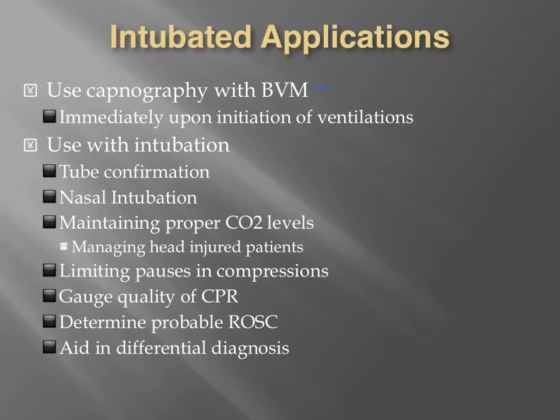That will help us get a truer measurement of carbon dioxide release from the lungs, because the measuring device is right at the tip of the mouth and nose, versus on a bag valve mask where you might have a little bit of extra dead space in the mask itself.